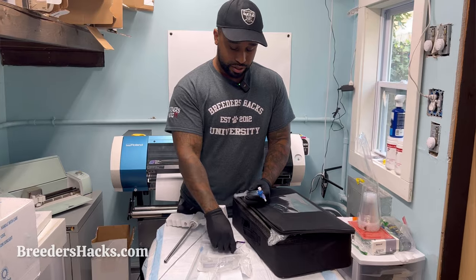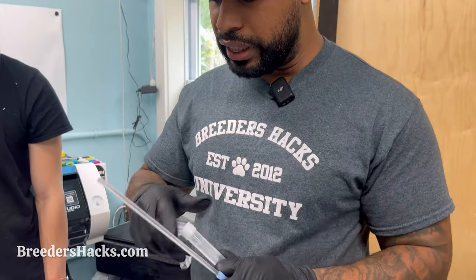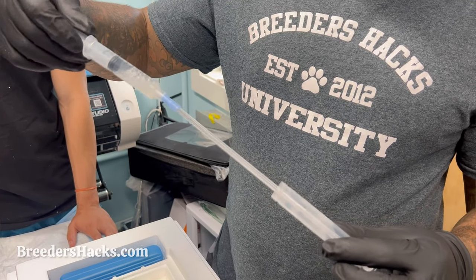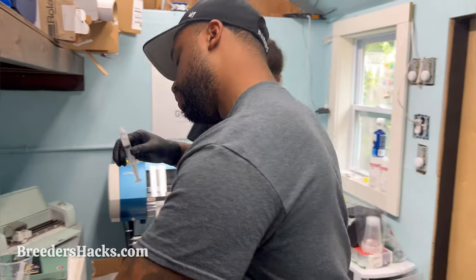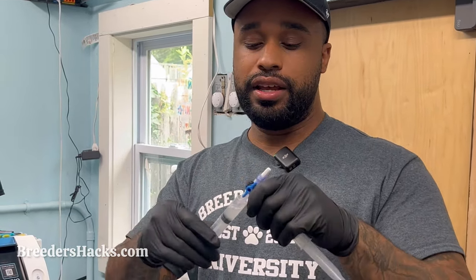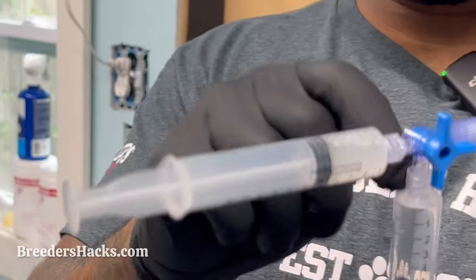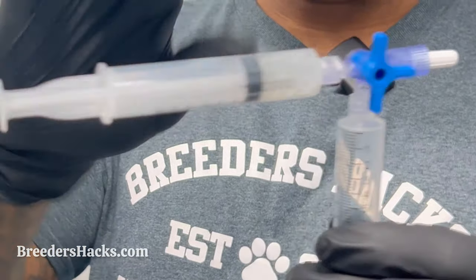You're going to want to have some lubricant. Now let's get started — once the semen is out, you want to start working quickly. We've already done a semen evaluation so we know the semen is good, and we've already done our progesterone numbers so we know she's ready to go. Take your AI rod and fill up the syringe — as you can see it's completely filled with our sample. Affix the collection to the three-way AI valve and twist it on. The key thing is to turn the valve so none of the semen can flow in or out of any other space — it stays right in the collection.